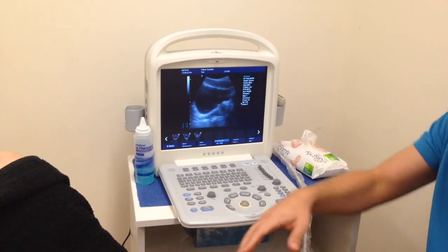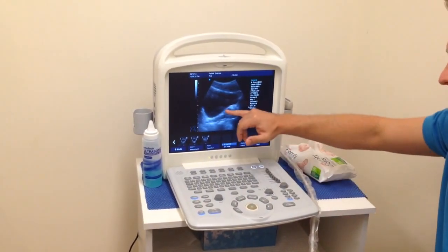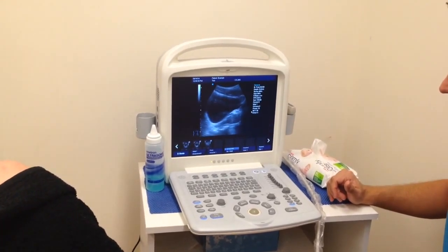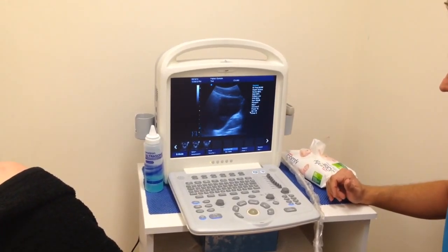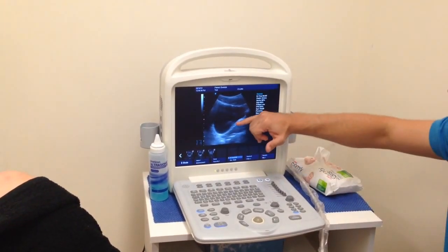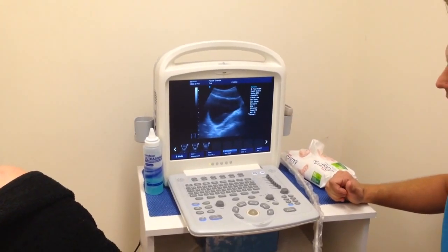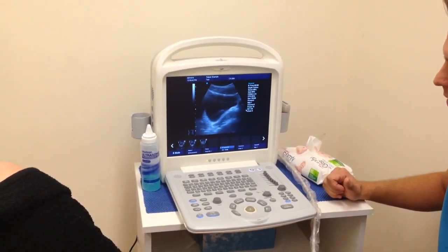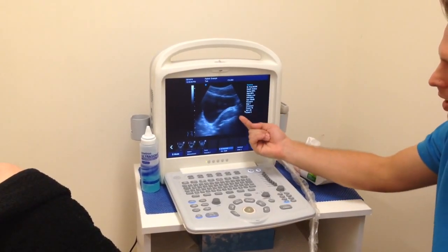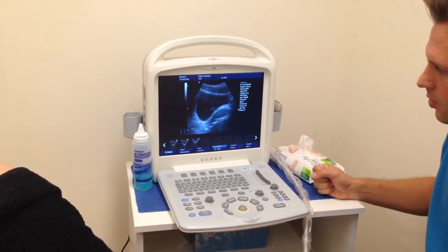Ben, if you're able to just do an active straight leg raise for us — let's see what happens. Ben's got really good control through there, so we don't see a lot of descent. Just do a Valsalva technique for us — perfect — and relax again. You can see the descent of the bladder down through there. Now just an active contraction of your pelvic floor — that's exactly what we want to see: that up and to the left movement of the bladder wall. And relax.